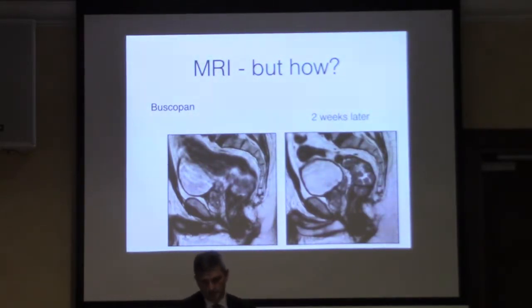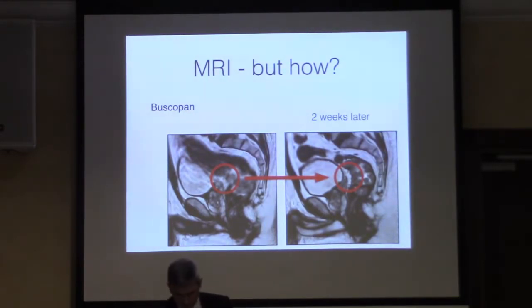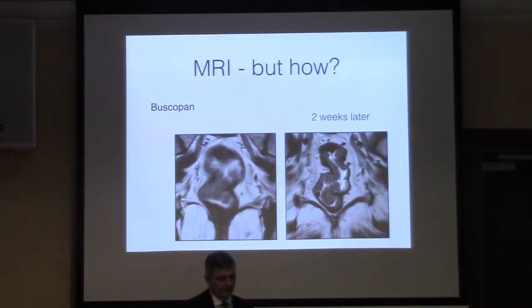So that really has allowed us to significantly improve the quality of the imaging. A lot of the standards that I'm describing to you, and let's just show you the corona, come from the European standards, from the European Society of Gastrointestinal Radiology, so ESGAR, and afterwards I can show you the document. So a lot of this is contained within that.